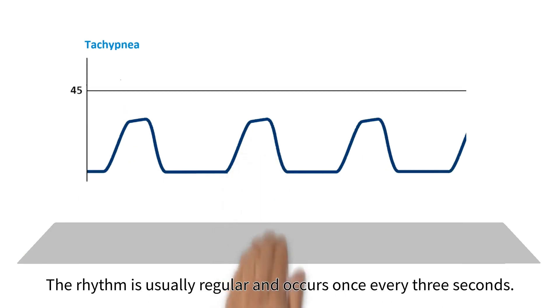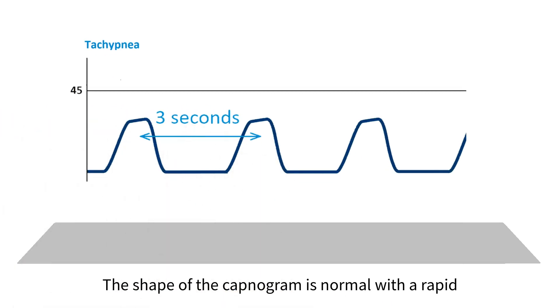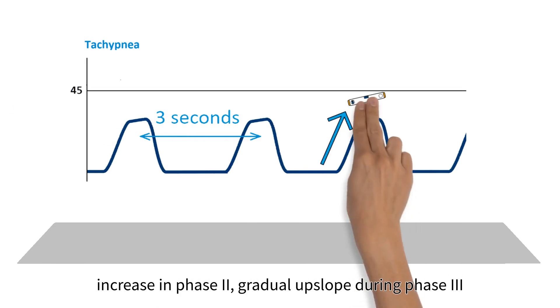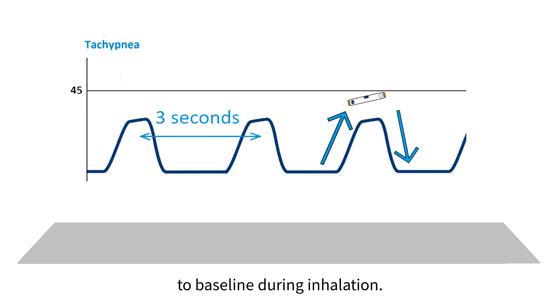The rhythm is usually regular and occurs once every 3 seconds. The shape of the capnogram is normal, with a rapid increase in phase 2, gradual upslope during phase 3, and abrupt descent during phase 0 back to baseline during inhalation.